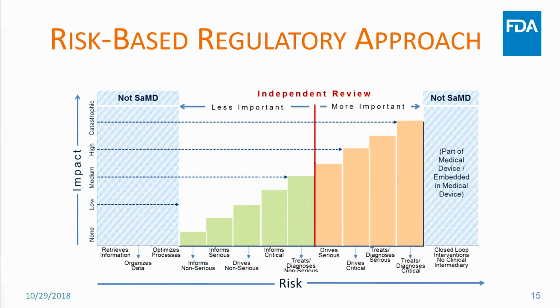Of course, with the adoption of deep learning and other possible approaches, we see that in commercial products. There's this idea that there's going to be a large increase in the number of these tools that come along, and that's what we expect. We're looking within that IMDRF framework of readjusting how we might approach software as a medical device, looking at the risk associated with it and trying to make determinations of what types of software we really need to regulate or see data on.